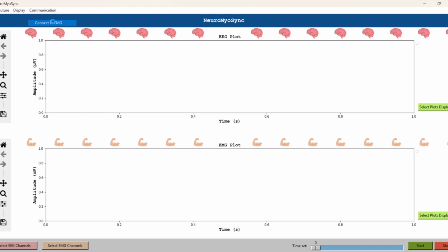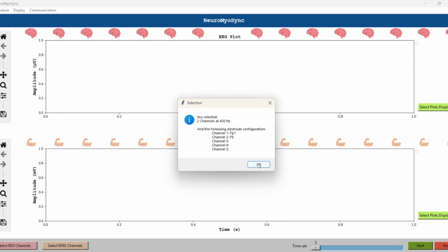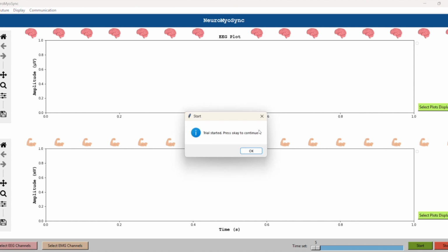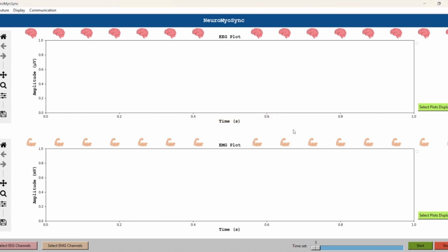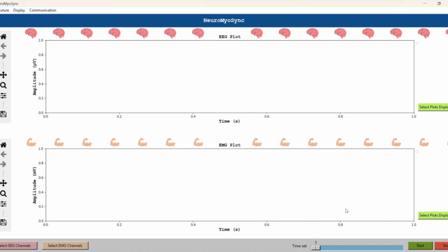To begin a trial, make sure you are connected to your devices and then make any channel, frequency, or label selections for the trial. Here you can set the time and then press start when you're ready for the trial to begin. Here's a pop-up from the devices letting you know that the trial is started. This pop-up lets you know that the trial is completed, and in pressing OK, data transfer will begin. Here you can name the file and save it.